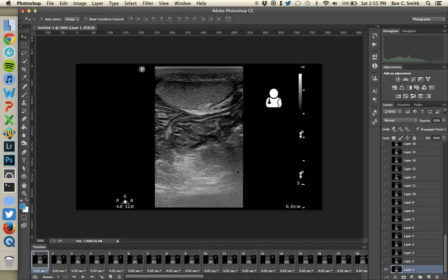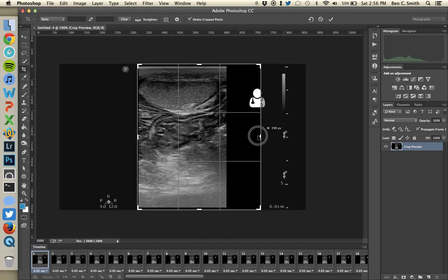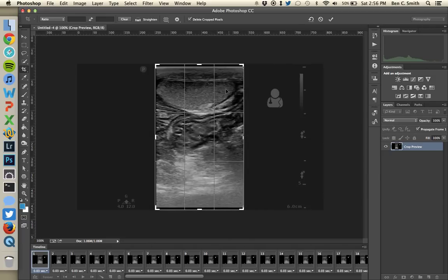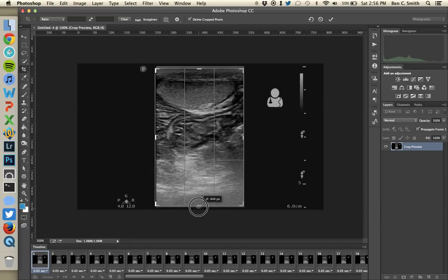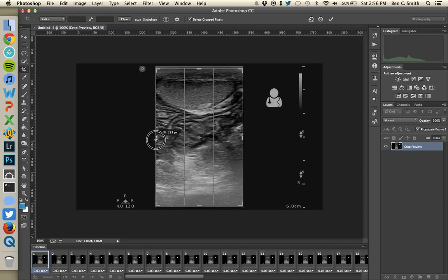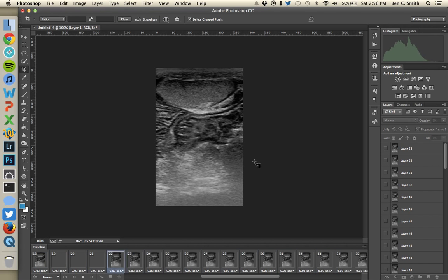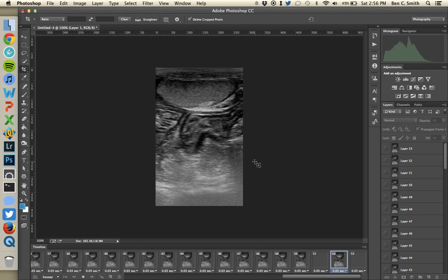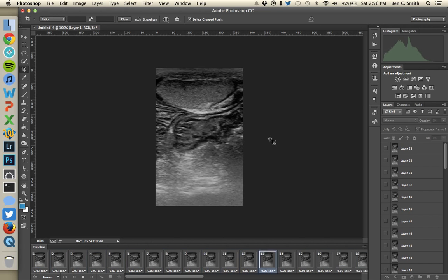After clicking OK, there's a lot of extra black space on the sides that I'll crop out. I'll hit the C key for the Crop tool, pull the handles in, and hit Enter. Now I've got just the ultrasound information. If I hit the space bar to preview, you can see that when it loops there's a big, obvious jump. That's what I wanted to point out, and there's a way to make that jump go away.